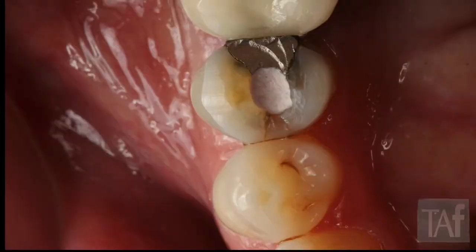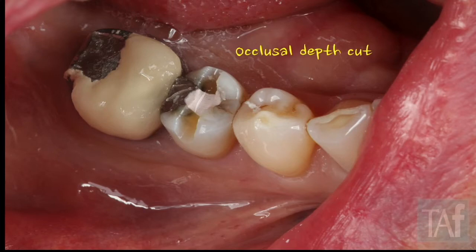Here's the occlusal view of tooth 29 — the one this older woman agreed upon. No big deal, it's a regular tooth. So here's step one: occlusal depth cut. Spear talks about doing interproximal contacts first, but personally I do occlusal first — it just makes sense to me. You get the depth cut because you have a starting point; you want to bury the bur. Typically if you're using full-contour or high-translucency zirconiums, you want two millimeters — go the whole bur depth, just get it in there. If you can't take this much off the tooth you're going to be in trouble anyway, so start from there and extrapolate out.